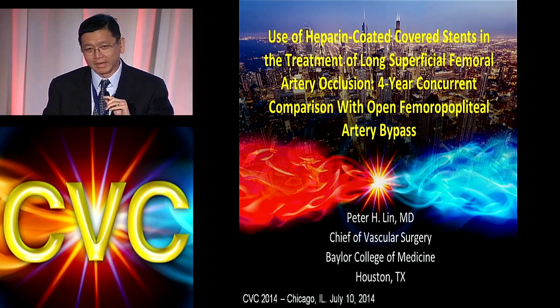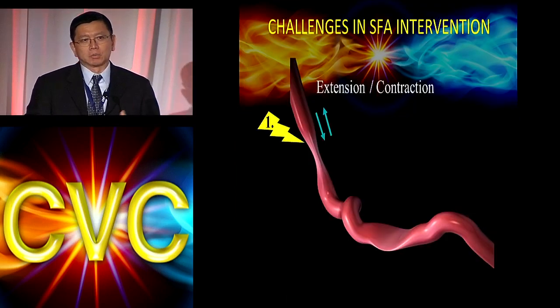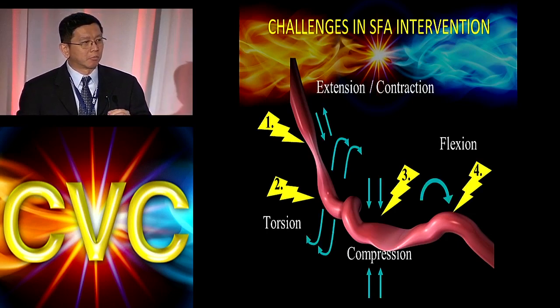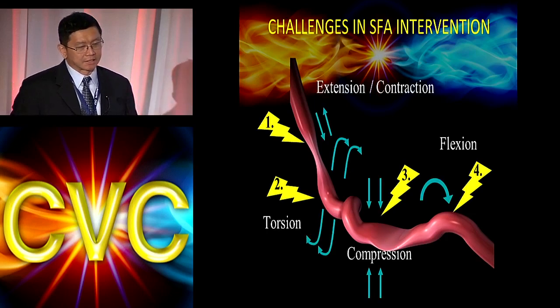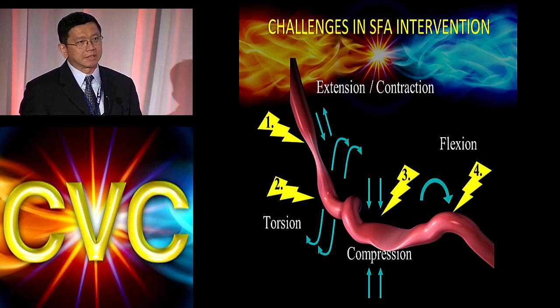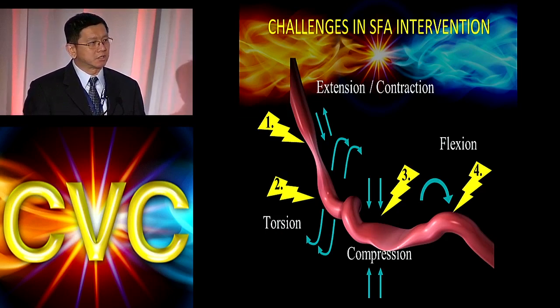Thank you so much. I want to thank the organizing committee for inviting me to this meeting. Treatment of SFA with endovascular intervention is something that many of you probably face on a daily routine in your practice. And I will submit to you that successful treatment of SFA lesions is not an easy task, in part because this vessel is very unique.